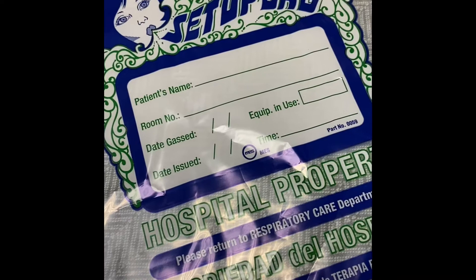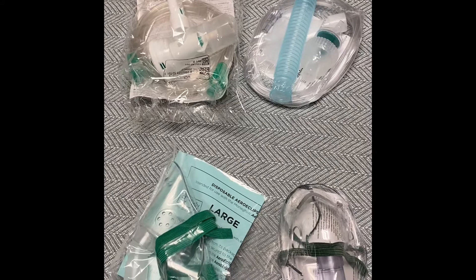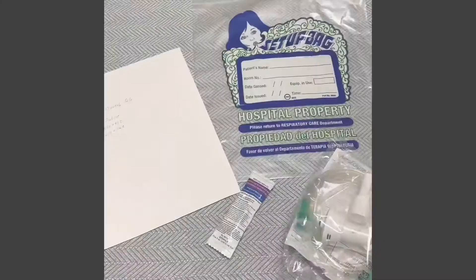This is where you're gonna keep the nebulizer after the treatment — this ensures keeping it clean. Mouthpiece treatments are the preferred method, but a mask is available as well.